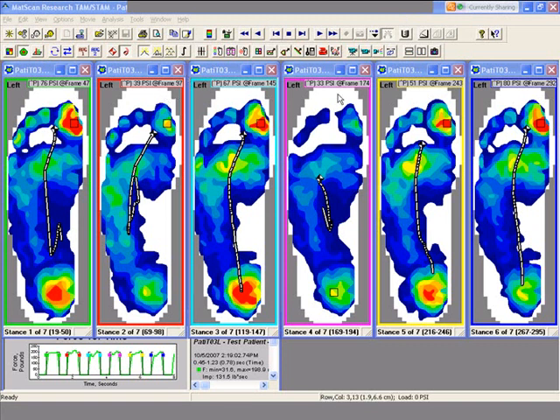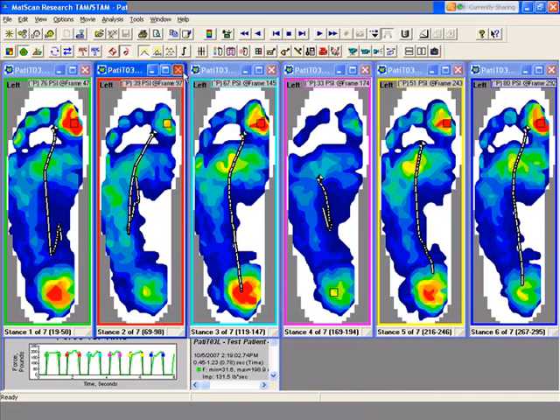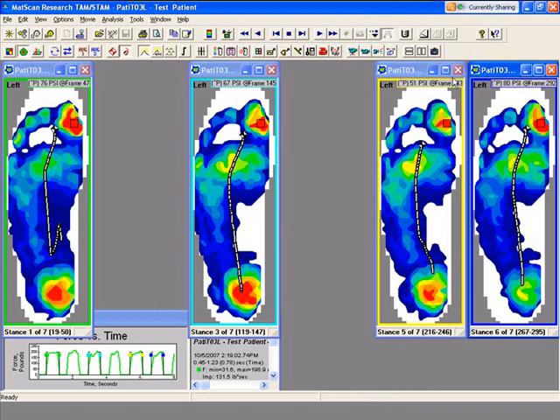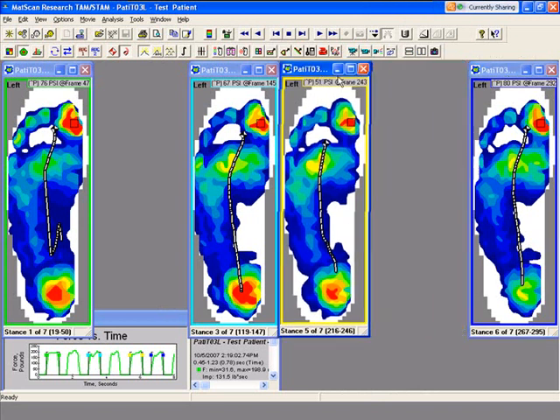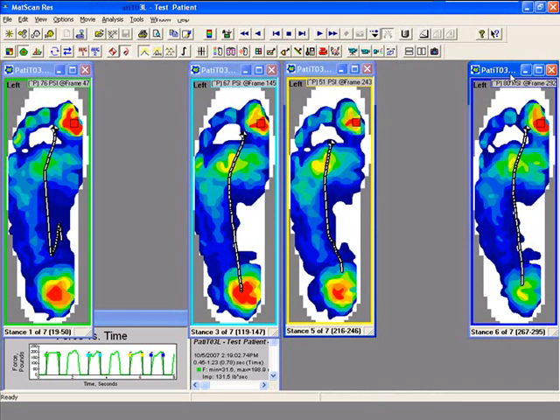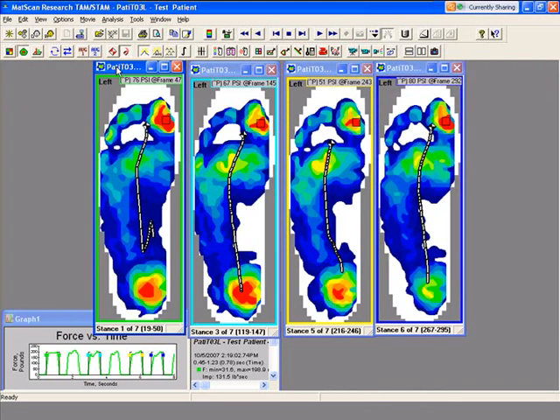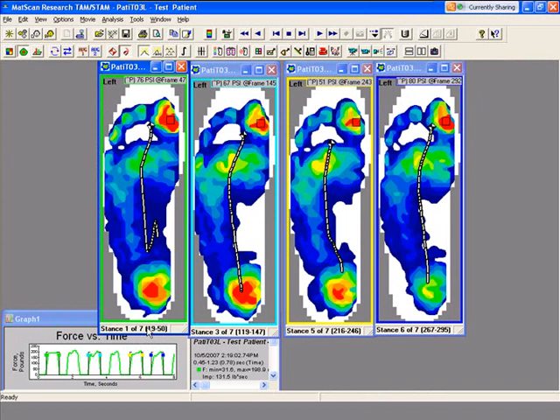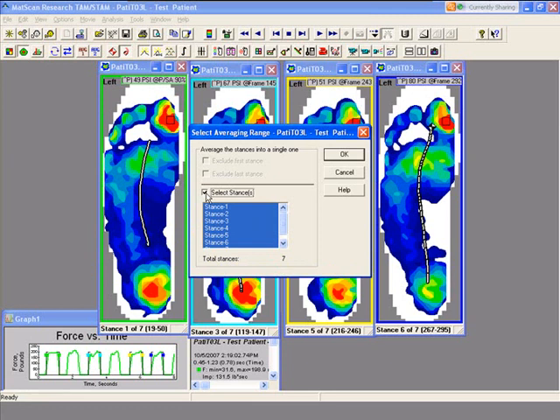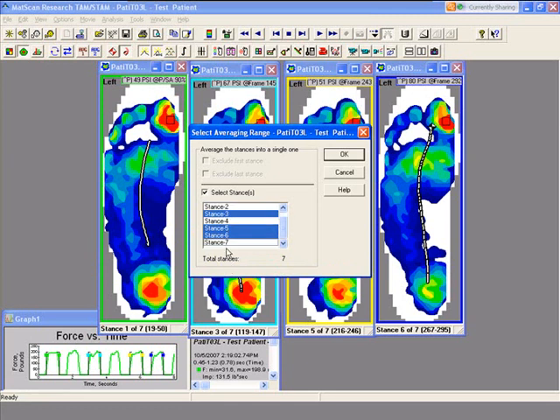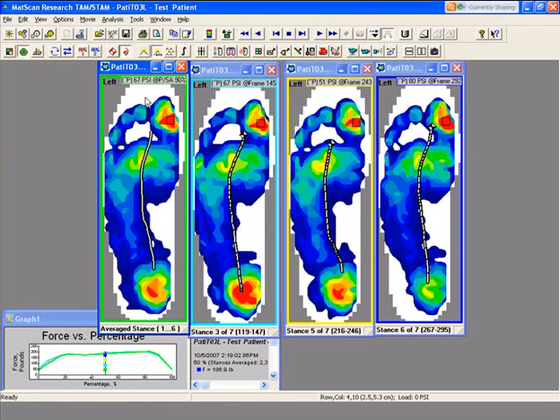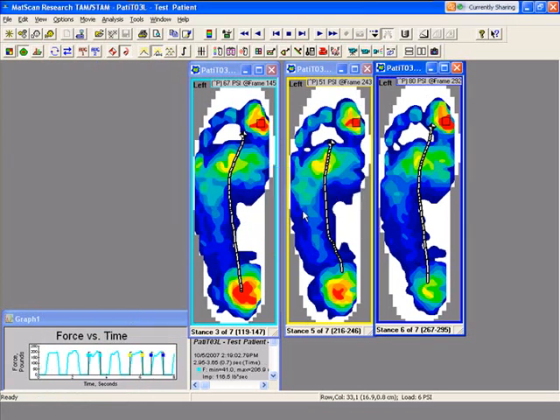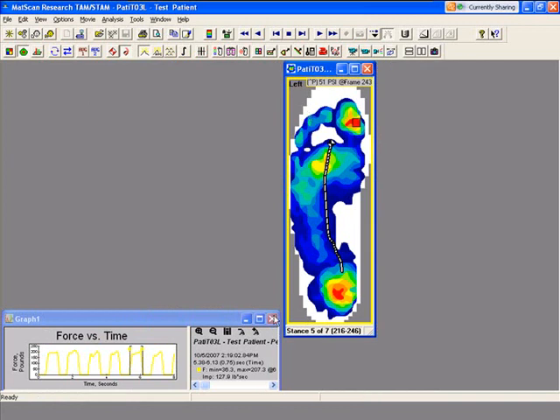What you do here is throw out the ones that aren't like the rest. Number 2 looks a little different, number 4 looks a little different, so we throw those out. Now when we go back to peak averaging, instead of averaging 2 through 6, maybe I just want to average 1, 3, 5, and 6. If I go to averaging, click on select stance, we wanted to throw out 2, 4, and 7. Now this is a better representation of the foot strikes.